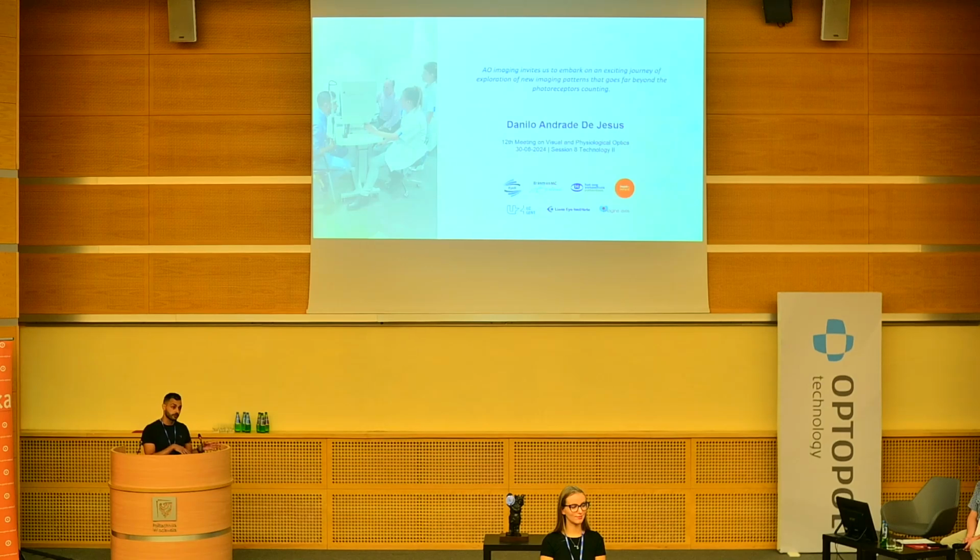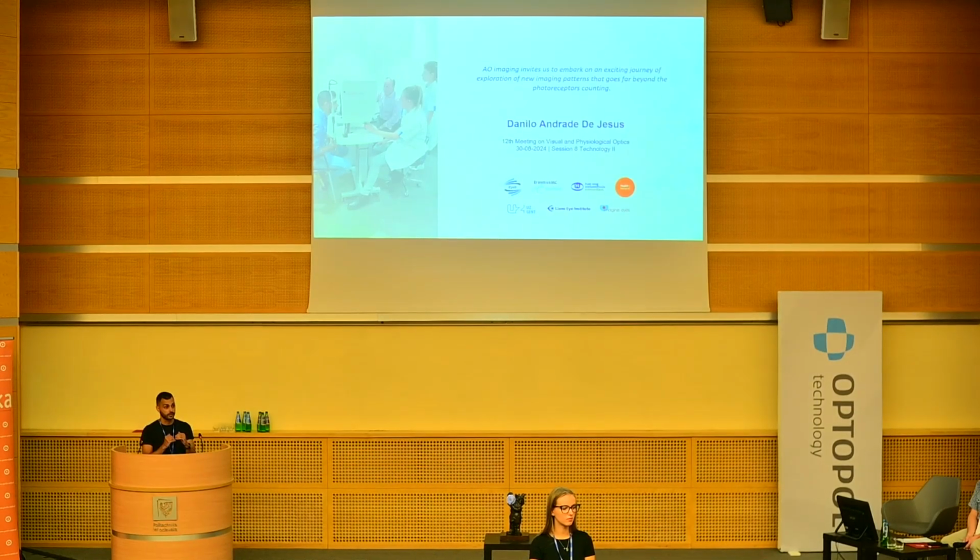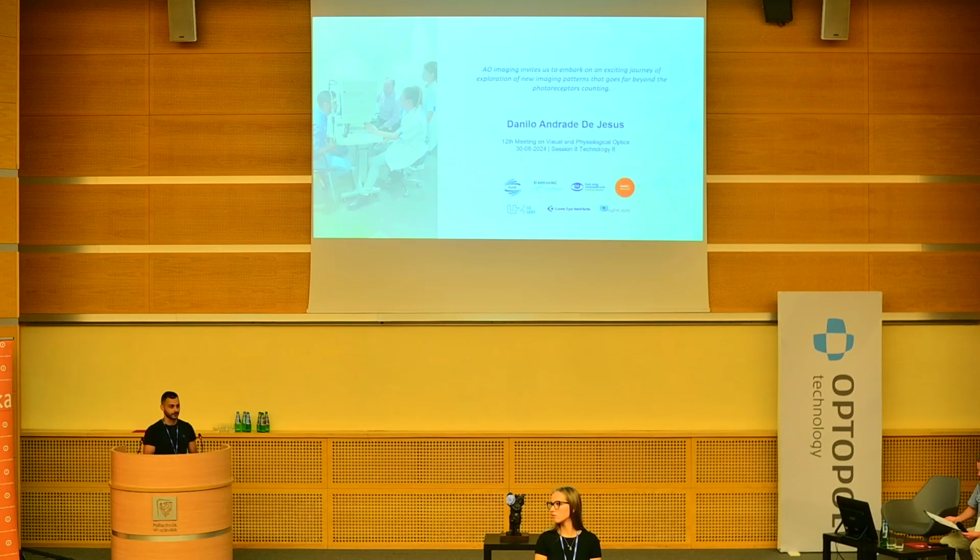It also has other applications that we are working on in Rotterdam, which is to see the recovery after surgeries. For instance, in macula, how the photoreceptors recover after the surgery, and we get really nice results. We can see the follow-up. We don't see differences only in the OCT itself, but we see differences in the AO images. And I think that AO has a lot of potential, but we just need to point the highlights in the right direction as well.